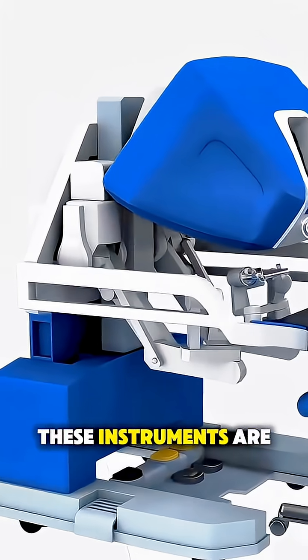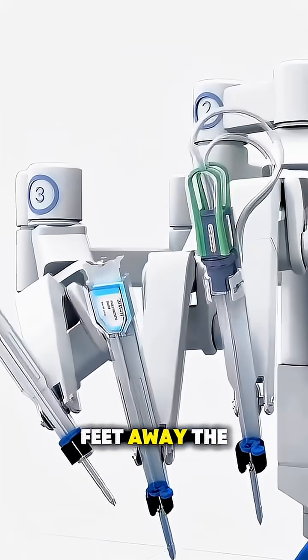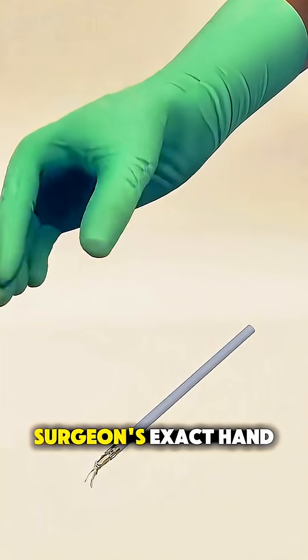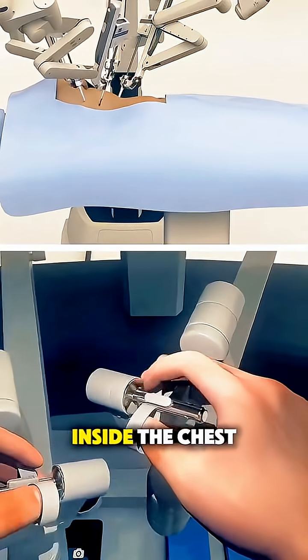These instruments are connected to a robotic system that the surgeon controls from a console just a few feet away. The robot doesn't act on its own — it translates the surgeon's exact hand movements into incredibly precise actions inside the chest.